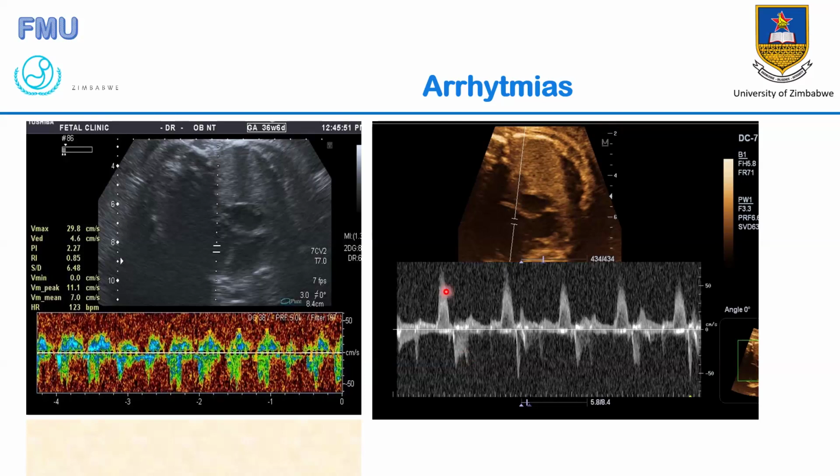So if we were to do the heart rates of the two, we may see that they are actually different. The atrial and the ventricular rate will be different. So this is why we want you to know what you are calculating. In most cases, when you are doing the heart rate, we want you to calculate the ventricular rate, because the ventricular rate is the one that fills the heart rather than the atrial rate.